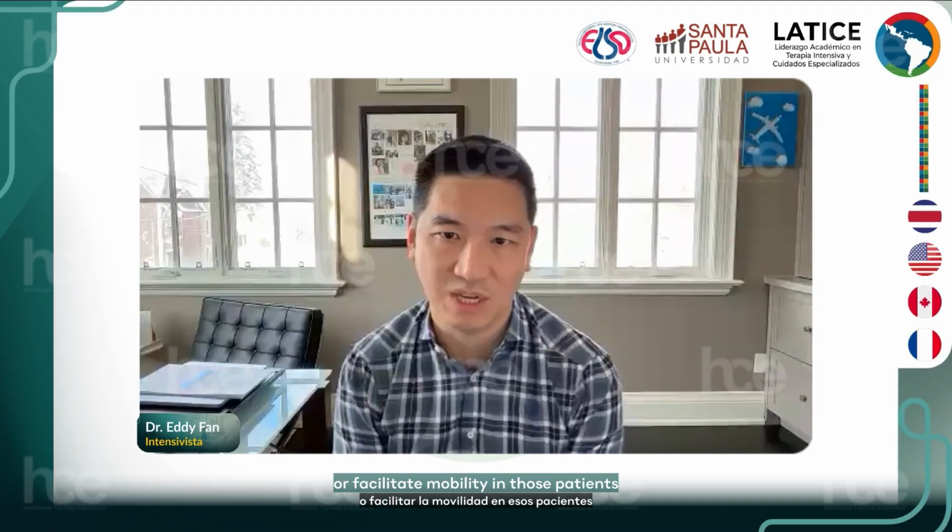And we also have used it in bridge to lung transplant patients for a similar reason, for the benefits, not necessarily of venopulmonary, but the fact that it's a single site upper body cannulation might assist or facilitate mobility in those patients and that sort of thing. But it certainly is an open question, and I know there are investigators around the United States and probably the world investigating the specific route for those to help answer some of the questions that you're asking.